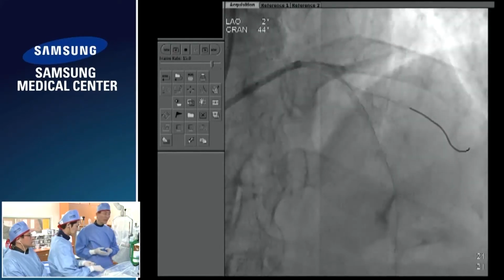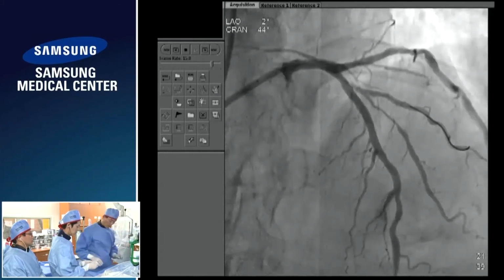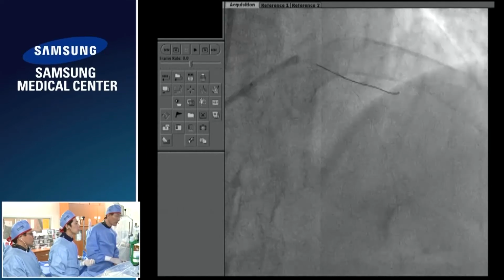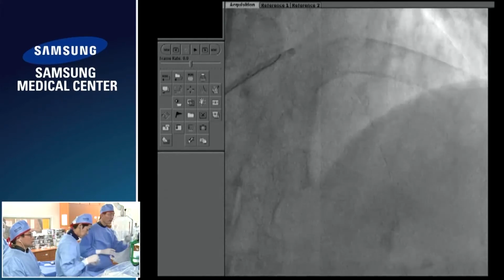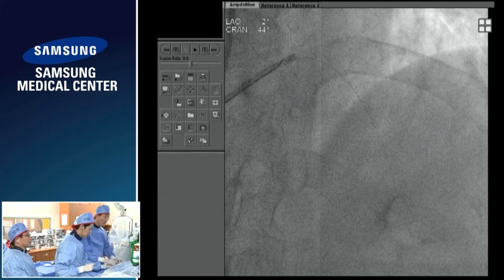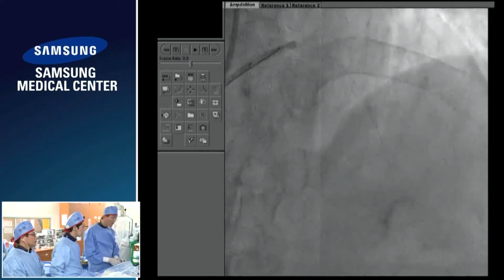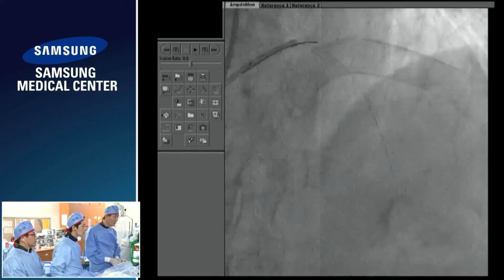If it is not working, I do the 3.5 balloon POT first for the proximal LAD. The reason why I just try the POT first is that I like to dilate more with the 3.0 balloon across the diagonal. That's very elegant, the idea of now taking a short 3.5 NC balloon can facilitate.